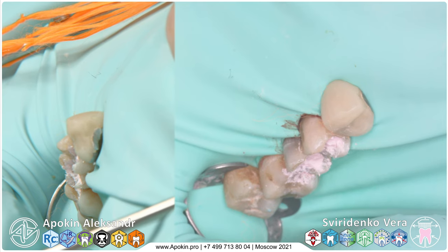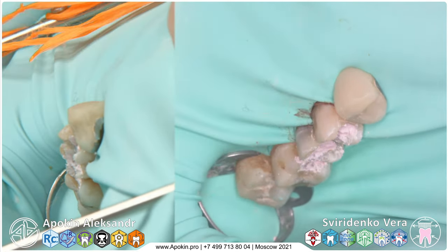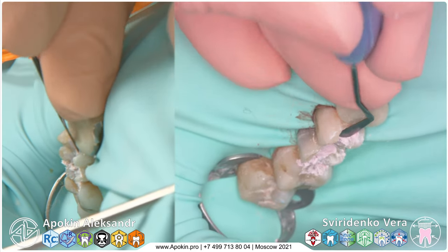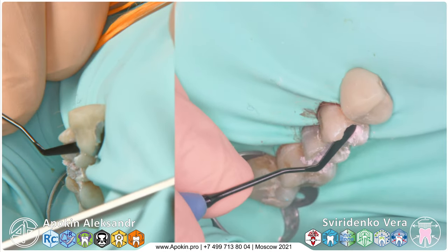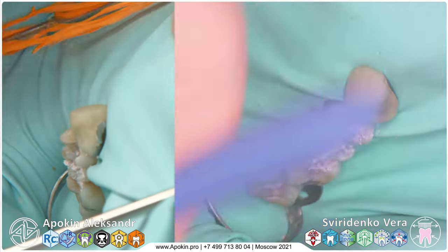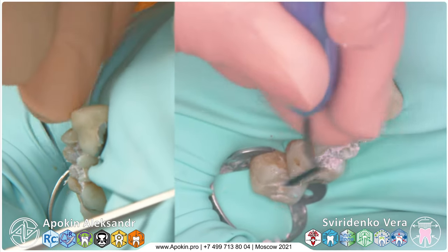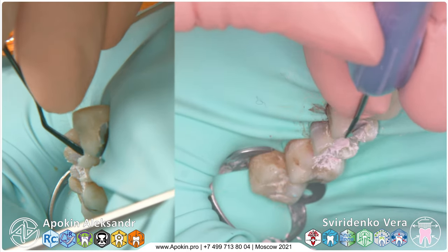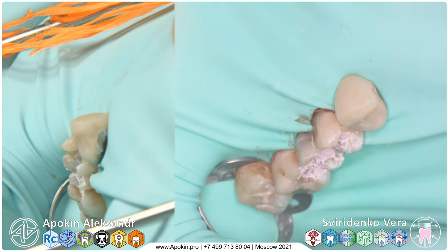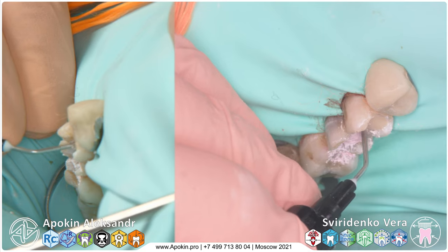So we continue to remove unnecessary part of temporary material to place flowable material, flow composite. This is not a waste of time because this covers very well for safety. All your work for a long time, especially when, I think this is not true, but our government says that this is true, and that COVID-19 is very, very dangerous, blah, blah, blah. So we cover it with this recipes. And I like it because all my patients come back with my work stable.